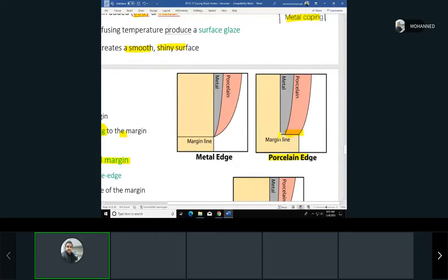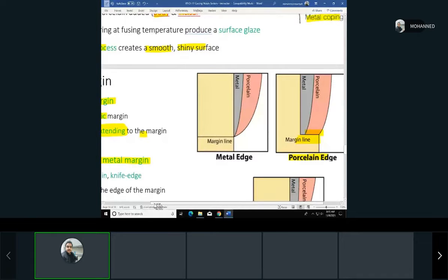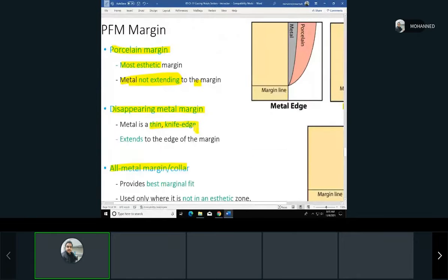That happens for some people. You will see when they smile there's a little bit of a silver line or a metal line on top of their crowns, and you can figure out this is a porcelain fused to metal. But if they made it all porcelain, you'll see how much thickness or width of the tooth they need when the dentist is preparing the tooth. The disappearing metal is a thin knife edge extending to the margin. You can see we don't need to prepare the tooth a lot. We don't have to make a base. It's just the metal sitting on the tooth.